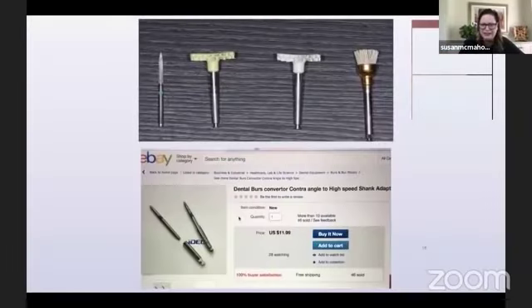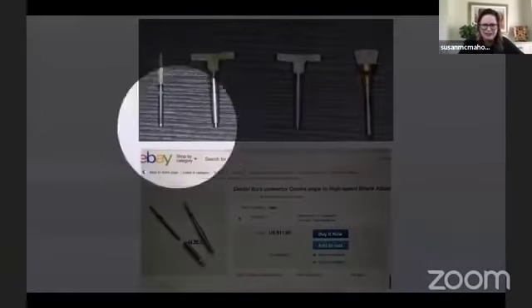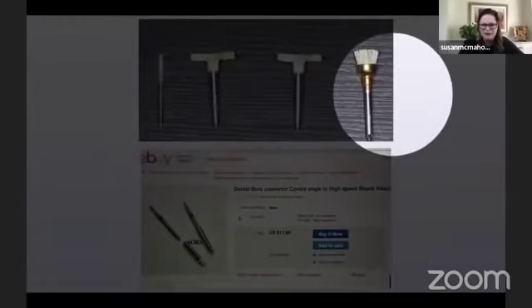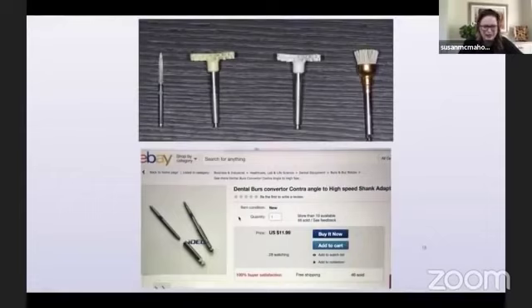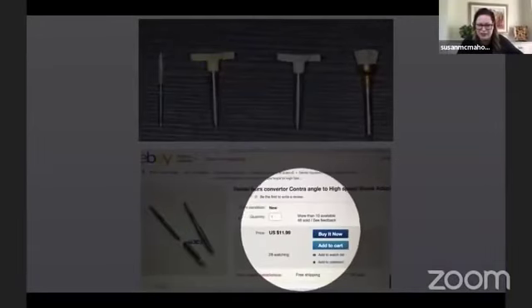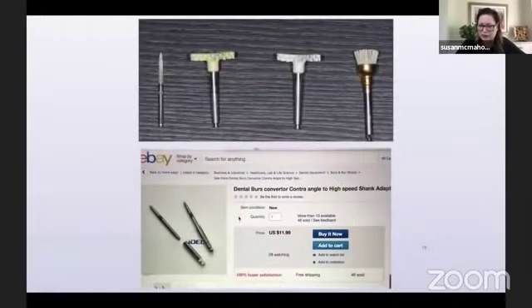And here's the setup. So a coarse diamond, two finishers from spiral finishers, and maybe a Jiffy brush with diamond paste on it. And then here's where I get my adapters. I order them from eBay. They cost $12 for 10 adapters. It takes forever to get here, but they always come.